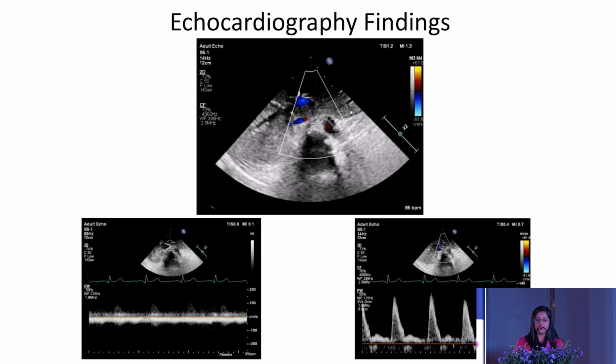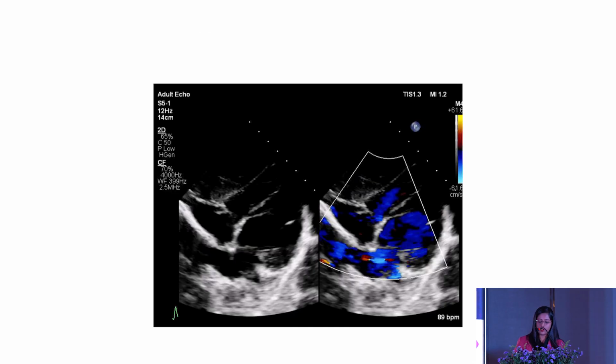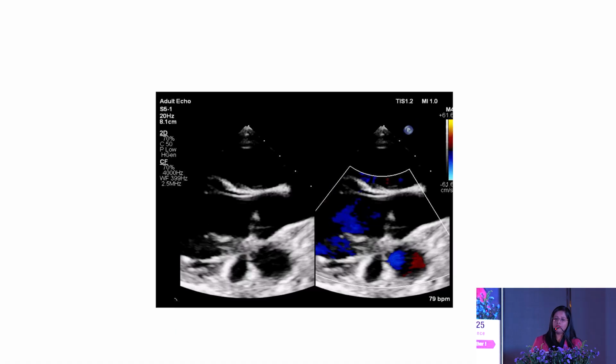Here the IVC is on the right and the abdominal aorta on the left, which shows situs solitus. We checked the position of the heart, which is levocardia, and we kept color sector across the interatrial septum and the interventricular septum to rule out any obvious shunting lesions. And we went to the thoracic imaging and focused at the aortic level. We found the NCC is mildly prolapsing, causing trivial to mild aortic regurgitation.